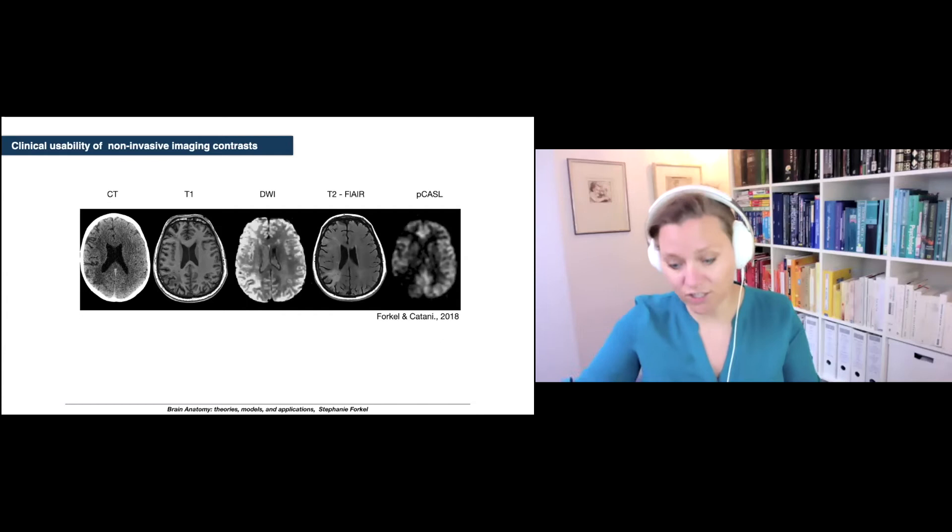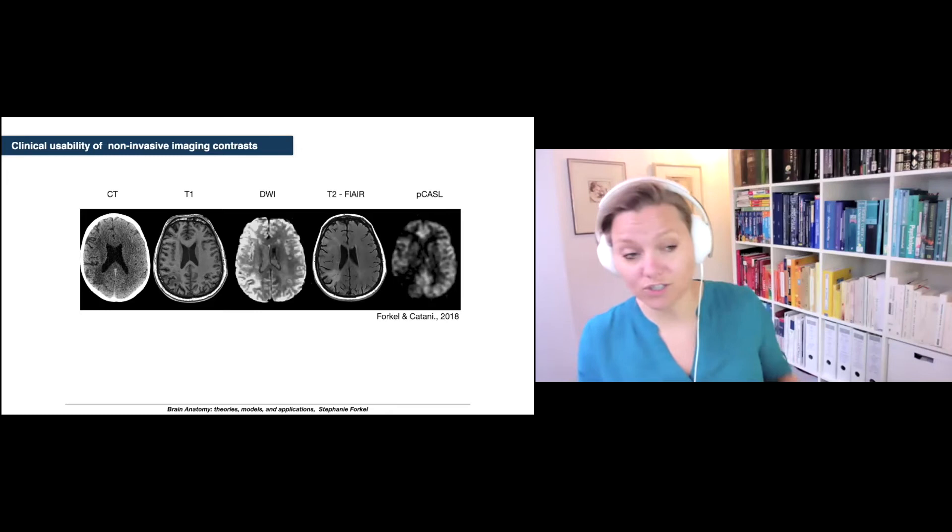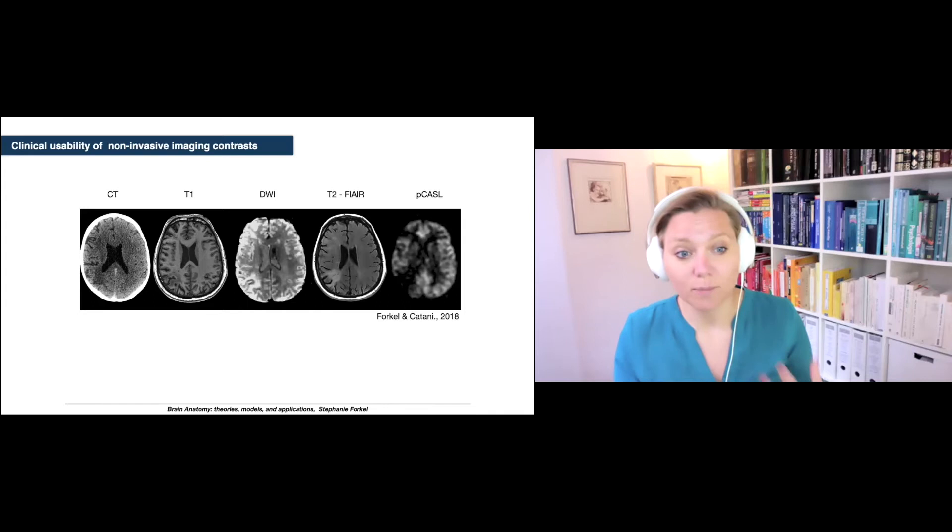I want to give you examples of what that actually means. This is taken from a publication from 2018 where we imaged stroke patients and you see this is the same patient with different modalities. We have the CT scan on the left, a classical T1 weighted structure scan is the second image, then you have a diffusion weighted imaging scan, a T2 FLAIR which is a clinical pathological acquisition, and then perfusion scan.